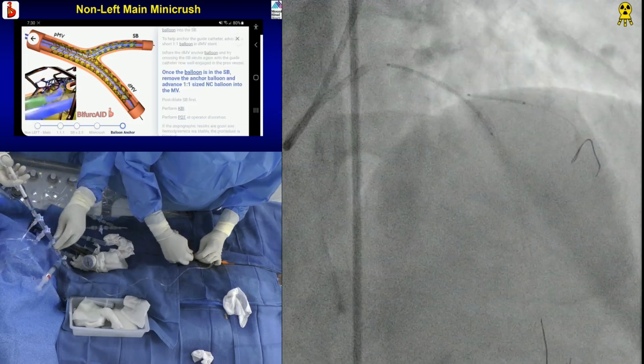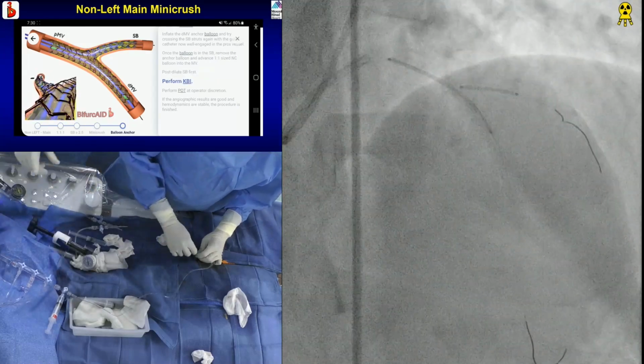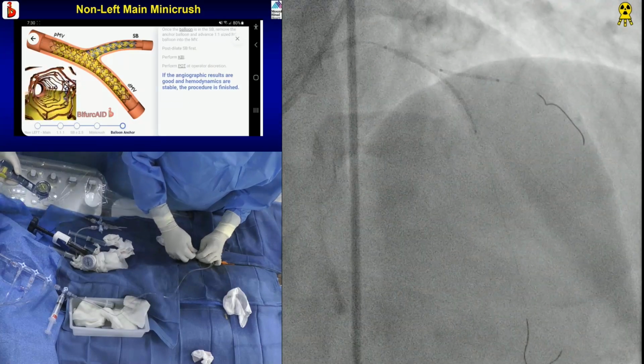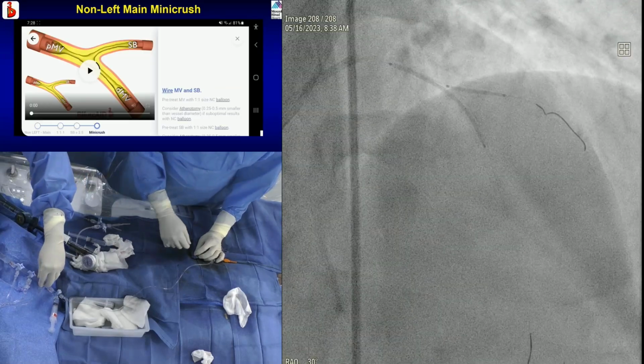Those are always stiffer. So we always tell everybody. And of the 3, 2 probably will be radial. So we have seen this correlation. No, all will be radial. Well, no, there was one other case where it was the groin, an RCA.